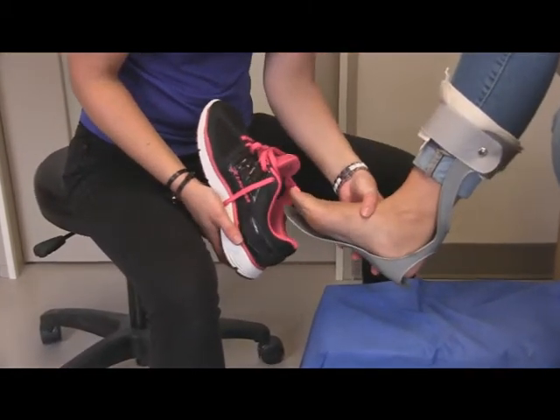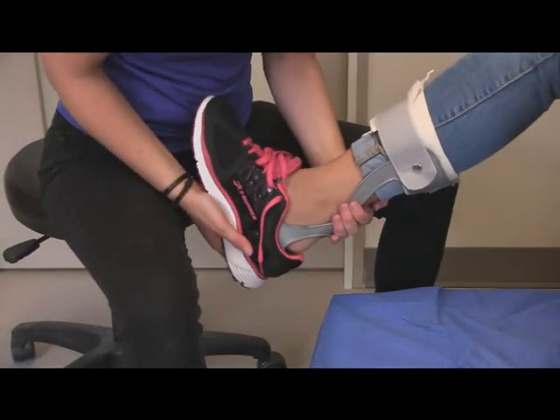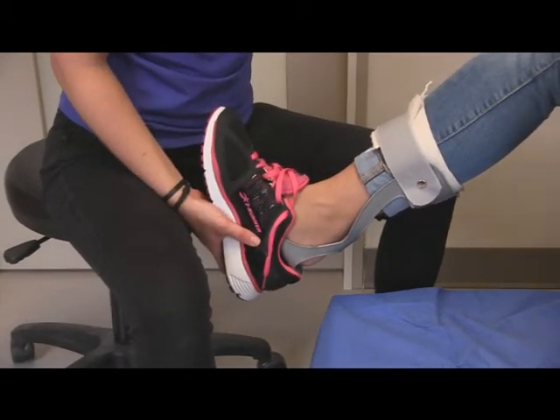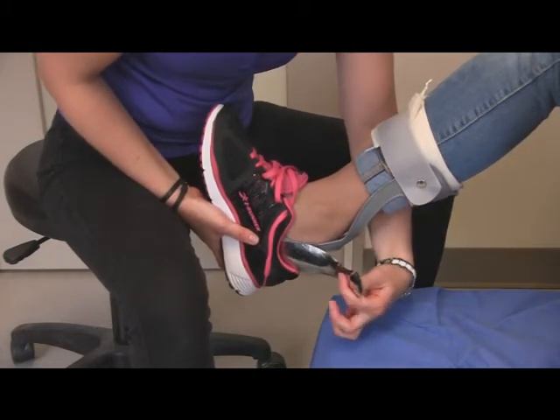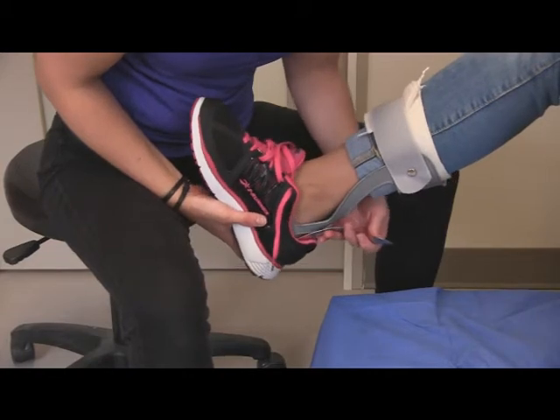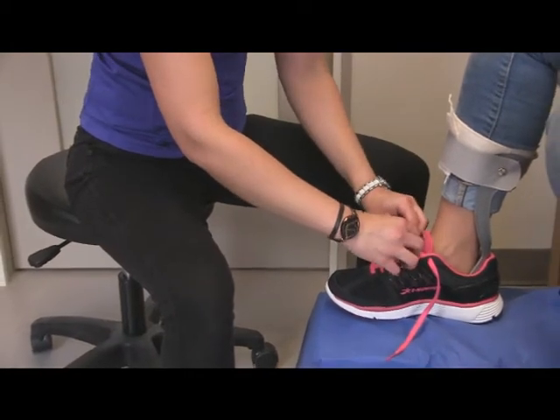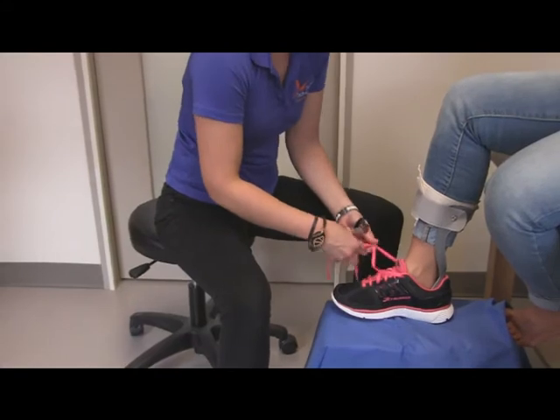You'll slide the brace and the patient's foot into the shoe, and get the heel of the shoe up over the brace. If you're having difficulty getting the heel of the shoe up over the brace, it may be easy to use a shoe horn, sliding it in between the shoe and the brace to the back of the heel, allowing the brace and the patient's foot to slide in. You can then attach the shoe, tightening the laces, and tying them as you would normally.